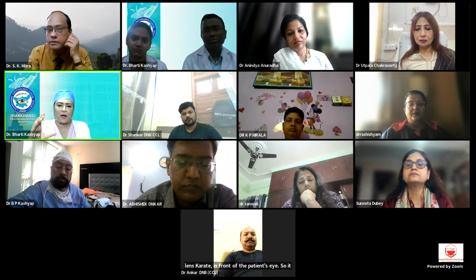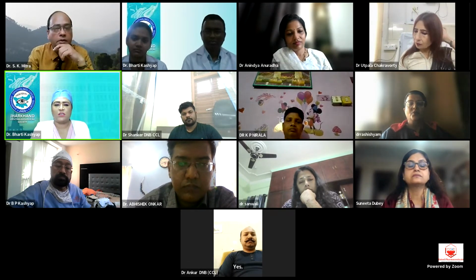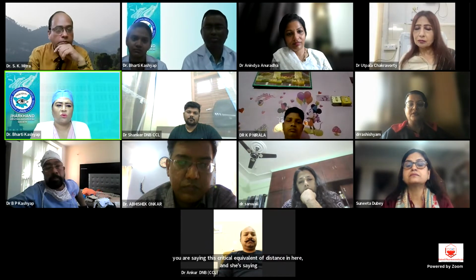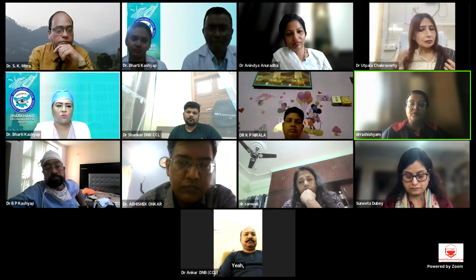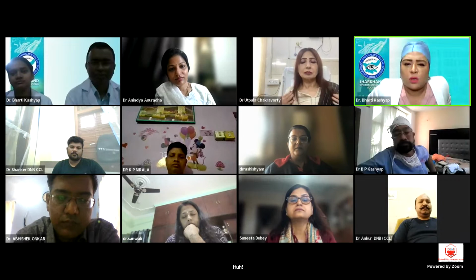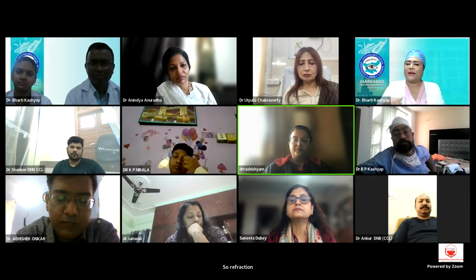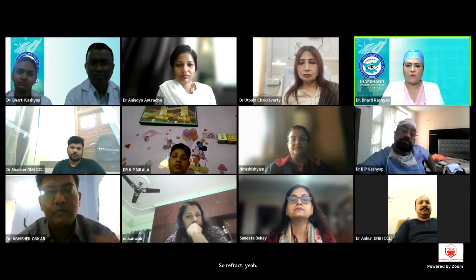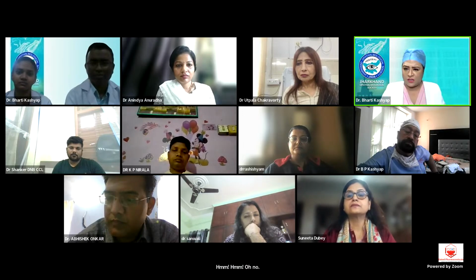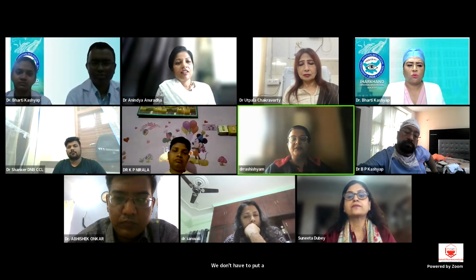नजदीक का जो effective power है, means you are saying a spherical equivalent of distance and near, and she is saying just suppose. So suppose there is a high myopic patient with -7 and maybe 50 plus years, so 2.5 also he is using. When we enter patient data, actually refraction has to be done before doing a visual field. So suppose patient को -7 का power है, okay? Please सुनो, ये बहुत practical point है. -7 का power है, 2.5 near में लगा रहा है, right? वो लगा रहा है, 2 लगा रहा है, तो उसको 5 का effective near vision करके टेस्ट करना होगा ना. We don't have to calculate ourselves. The machine calculates and tells us, because उसमें cylindrical power भी हुआ ना.